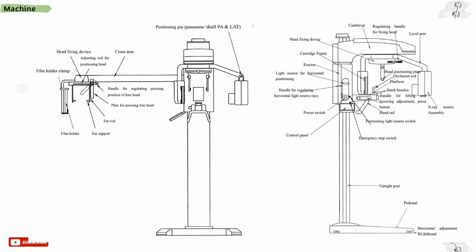Although it might not be necessary for a dentist or an orthodontist to know the specific parts of the machine or the terminology of the physical parts, it's also good to touch upon the main parts of the machine. It includes the collimated X-ray source that is placed 5 feet from the mid-sagittal plane of the patient, the cephalostate, which is the head positioner.